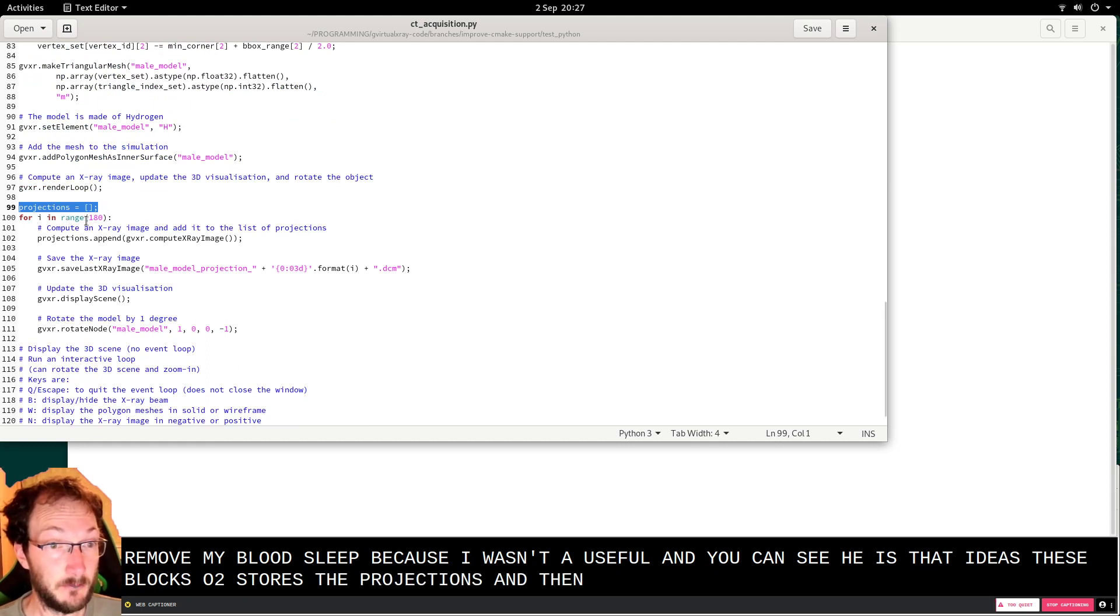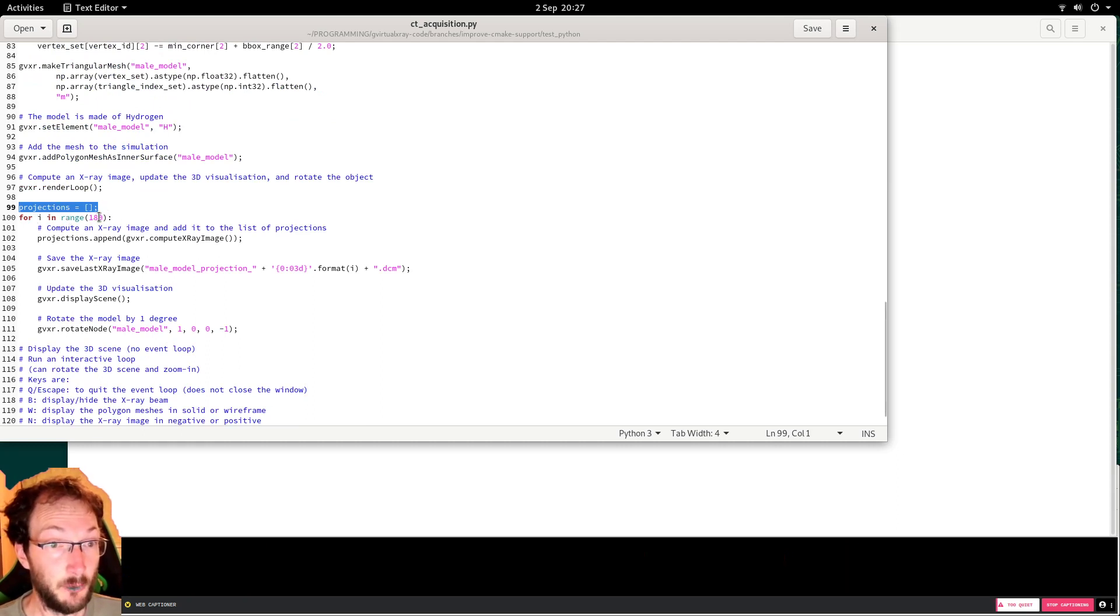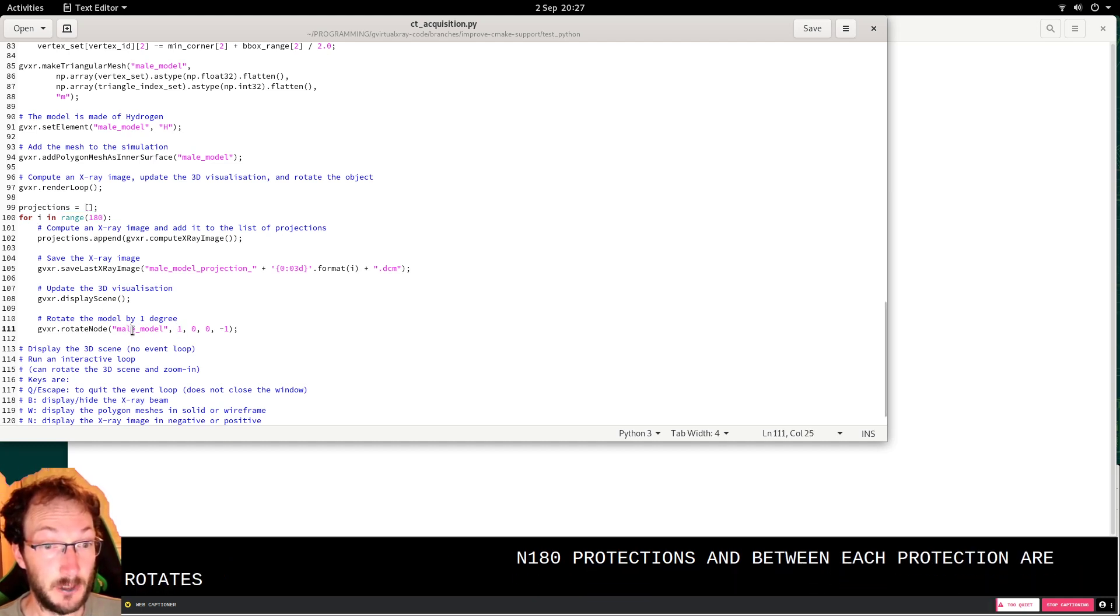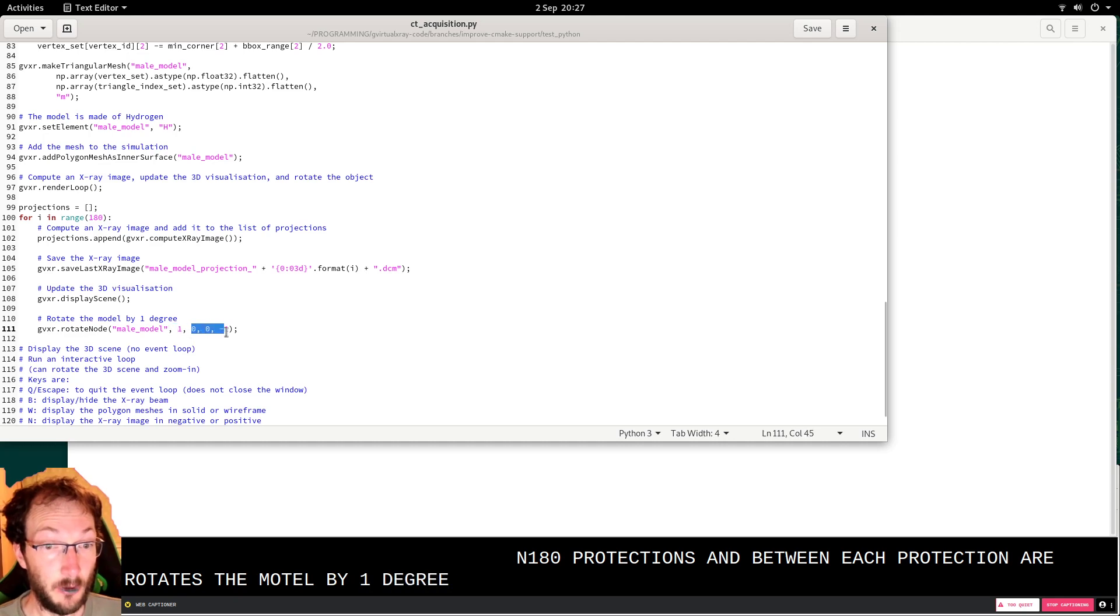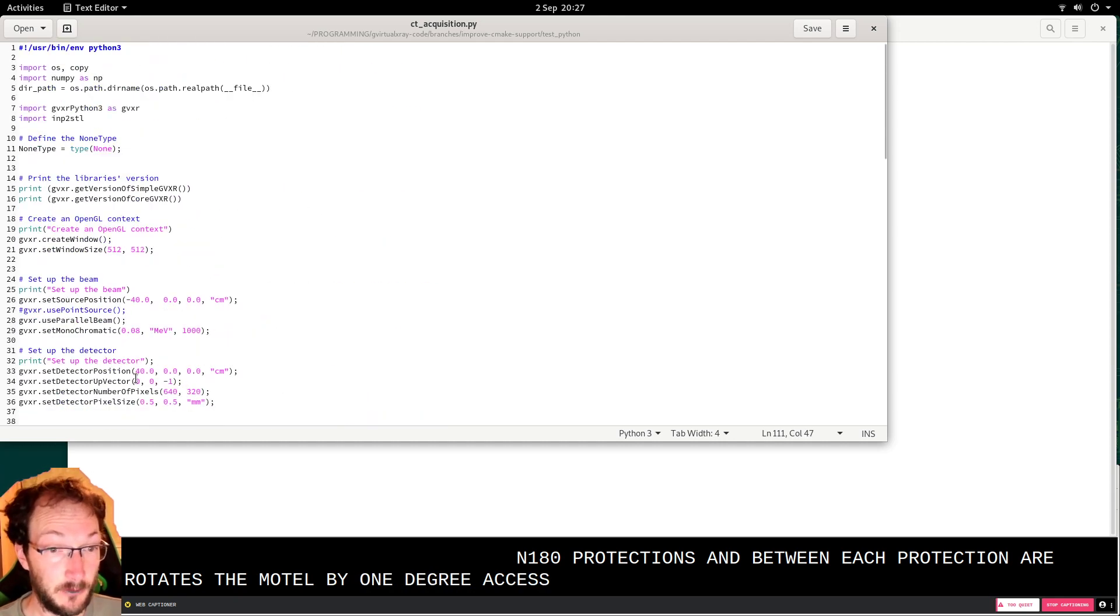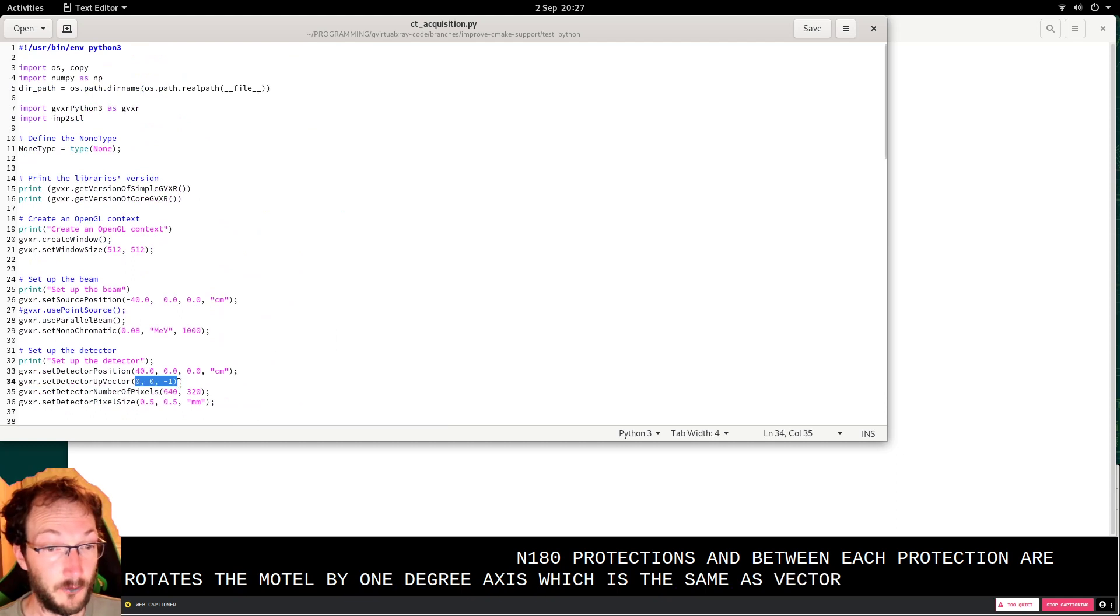And then 180 projections, and between each projection I rotate the model by one degree around this axis, which is the same as the up vector of the detector.